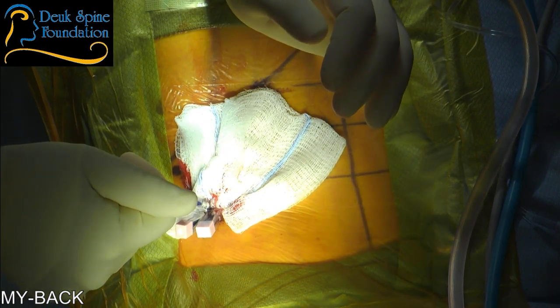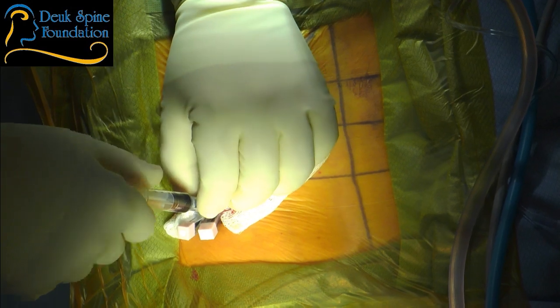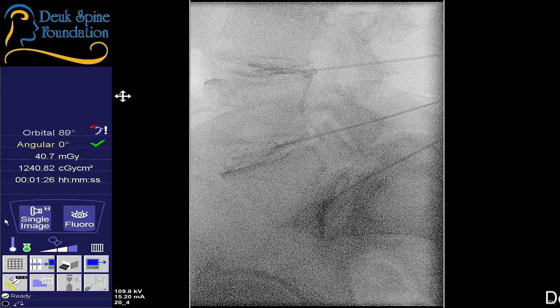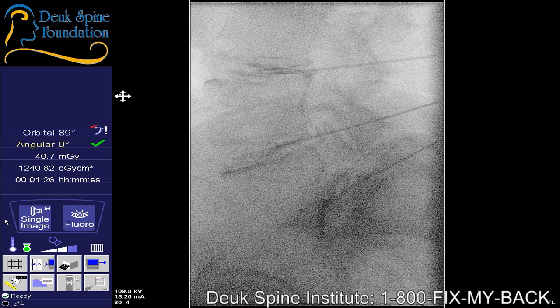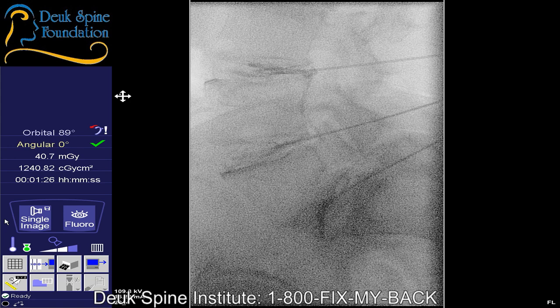Okay. That's L3-4. How bad is that on a scale of 1 to 10? 9 out of 10, is that where your pain is typically? Yeah. All right, so you see the value of discography, right? Evocative discography. I don't know if you use that in your practice or not. No, I don't. But it is extremely valuable. It's the best tool there is in the world for determining if a patient has discogenic pain.